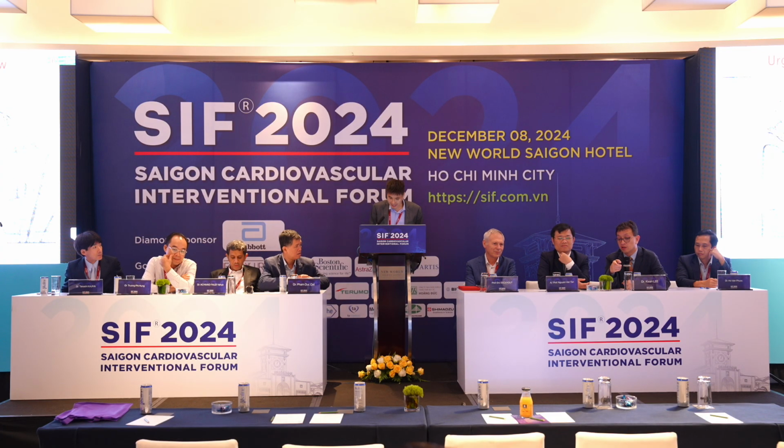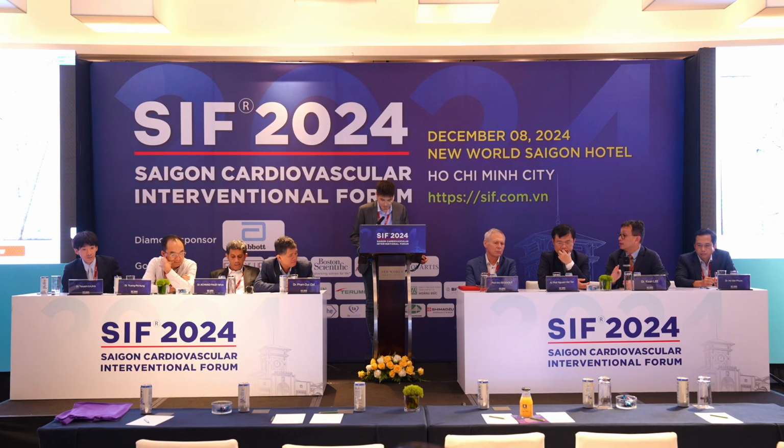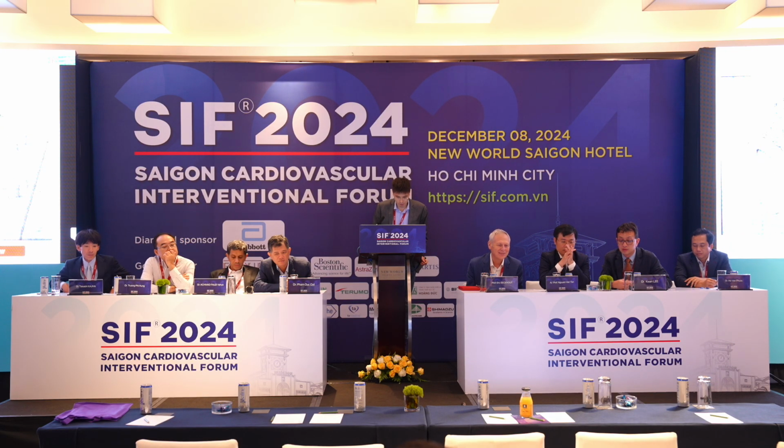That leakage is not tiny, right? The last time it was smaller. But if you look at the picture on the right, just injecting into the coronary, and you're not injecting very much, there's so much contrast crossing over from that small injection that it is not a small hole. I had another aortogram, but I'm afraid I could not show you. Okay, but I do agree with you that we should fix it. That is my main lesson that I learned from this painful case.